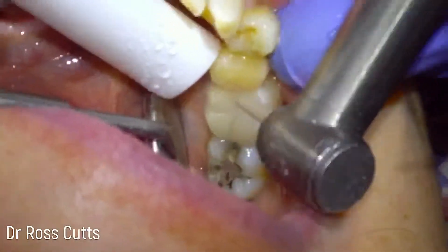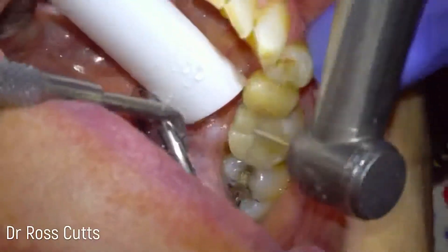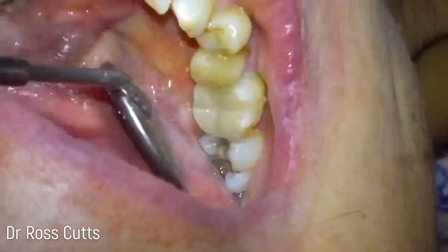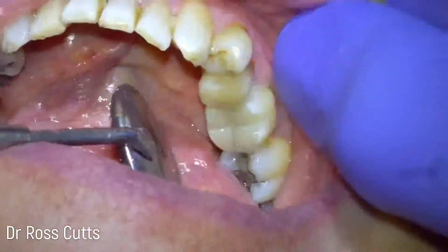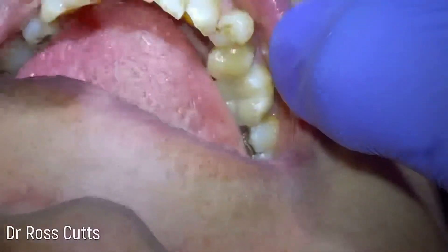Sometimes I just like to add a bit more detail to the occlusal surface — the chewing surface — just to make it a bit more tooth-like. And hey presto, there's our tooth. Thank you.